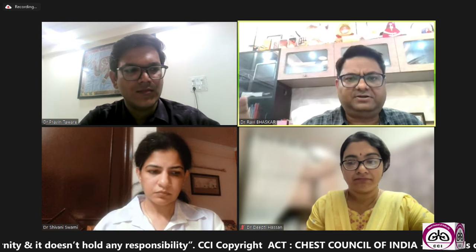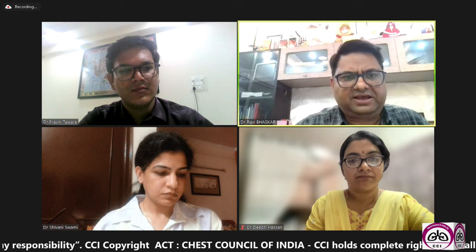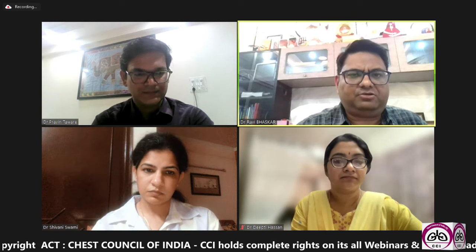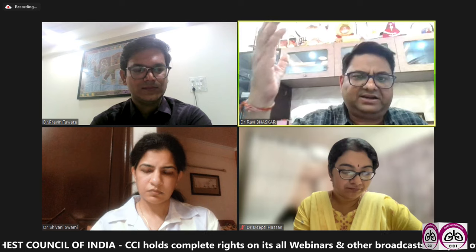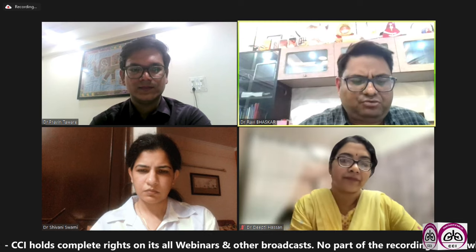So it's difficult. There are certain things which we can do, because kids cannot generate so much inspiratory flow to open the valve of a spacer. Like with the Zerostat VT spacer, we can tilt it upward slightly so that its valve gets opened when we are giving the inhaler to kids. This is a maneuver which we can do.